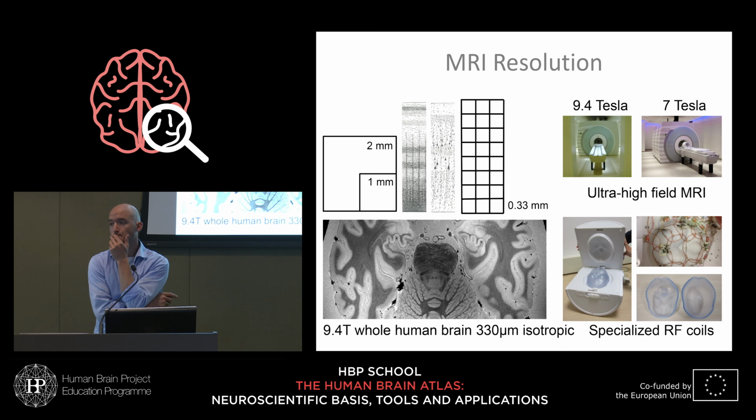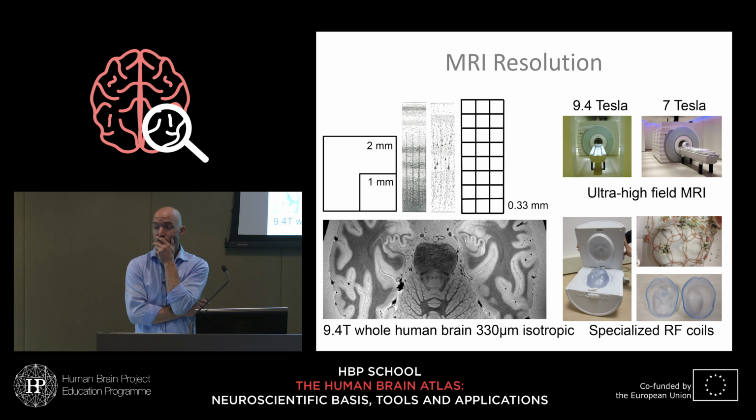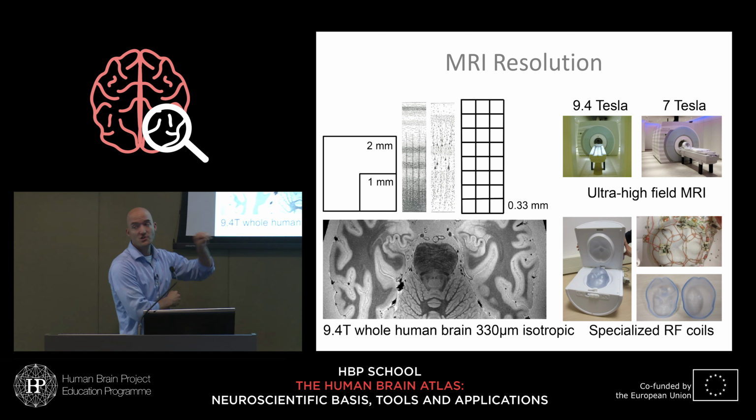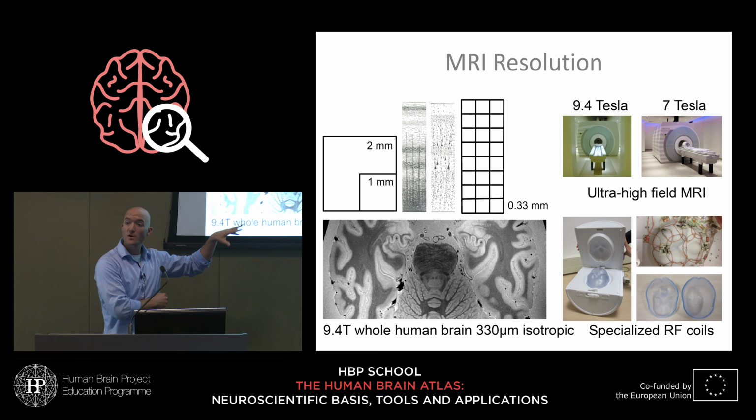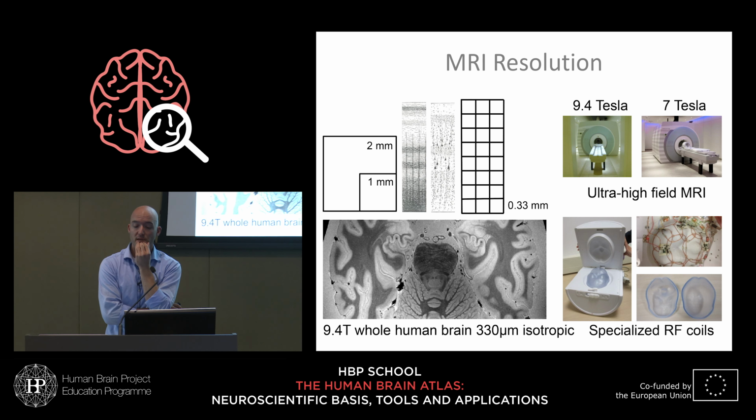So in this case you need to invent your own reconstruction algorithm. That's right. This was the last image that the scanner could reconstruct. Everything I'm going to show you next, because this was the work we did 3 years ago, and we're going to go much further down in recon, the scanner can't even handle anymore. So the first thing we do when we walk in on a Friday afternoon, when we're going to measure for a weekend, is turn the scanner recon on, and we look at the quality of the basic 500 micron images to see, okay, we've got our transmit right, we've got our receive right. Then we turn recon off, and the scanner runs for 60, 70, 80 hours, and we don't see data. All the raw data goes to another server for the recon.